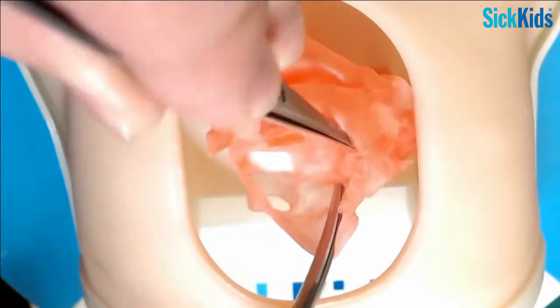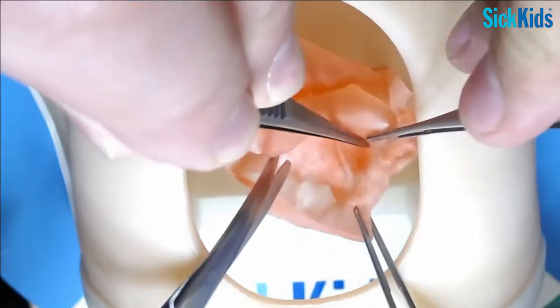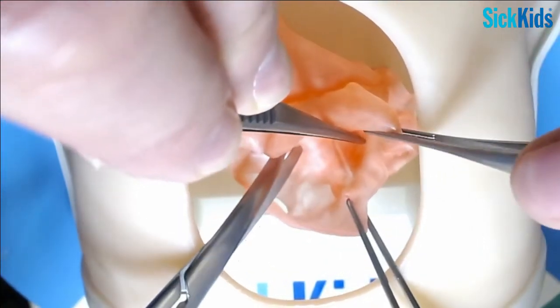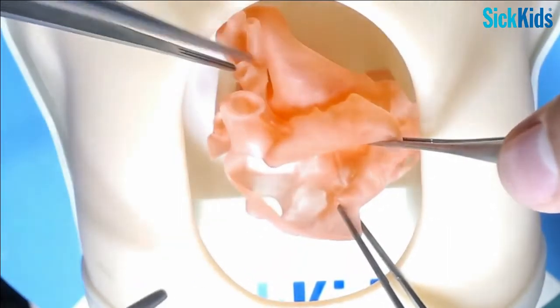Take out the ASD. Usually the coronary sinus is sitting about right here, and usually I'll drop my scissors down in the coronary sinus and cut that back like that, and now you have a much bigger ASD.